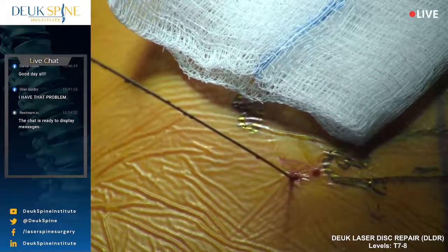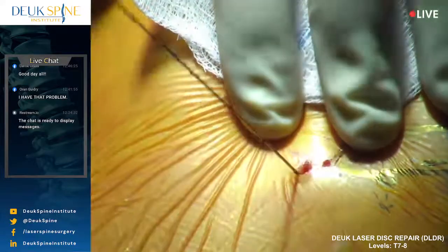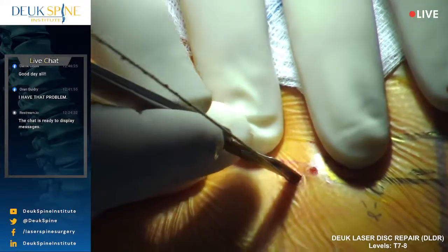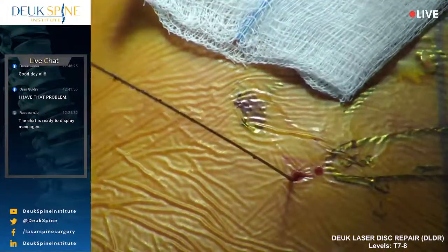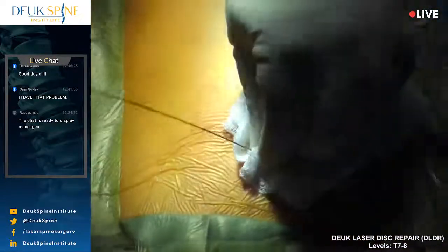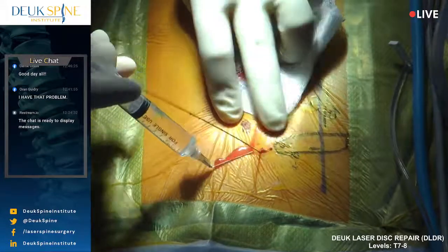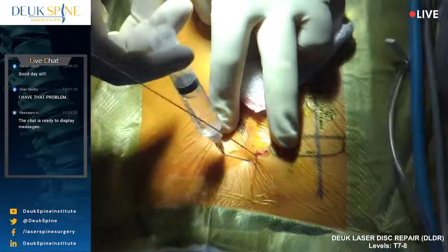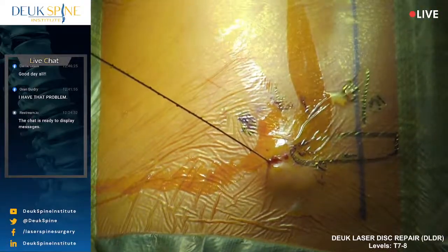All right, he's a little too light. Maybe, I don't know, but I just made an incision. He's moving a little bit. I mean, I numbed this area up. So let's just keep an eye on it for a moment. You don't have to give him more sedation. I don't know if he's coughing or just responding. I'm going to give a little bit more numbing medicine. So you're happy? Blood pressure looks good. So he must be asleep. This is just some more numbing medicine just in case he's feeling it. Yeah, he's definitely feeling something, but that's okay. There's definitely lidocaine in there, right?